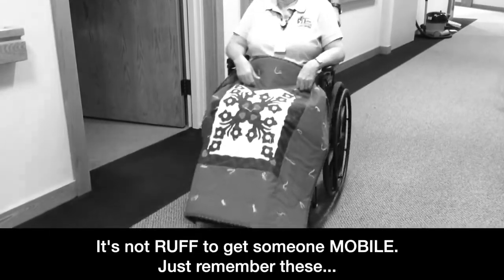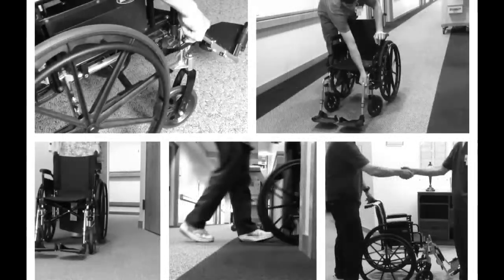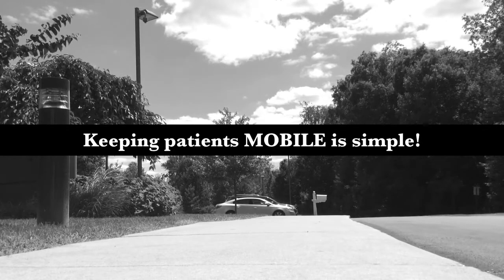Great work! Now let's get mobile! It's not rough! To get someone mobile, just remember these: test each brake and foot pedal, pull wheelchairs through doorways, find a staff member to transfer. Are your paws on the foot pedals? Do you have wiggle room? Shall we use an arm pillow or blanket? Keeping patients mobile is simple.